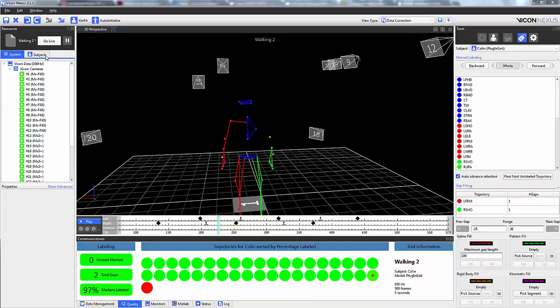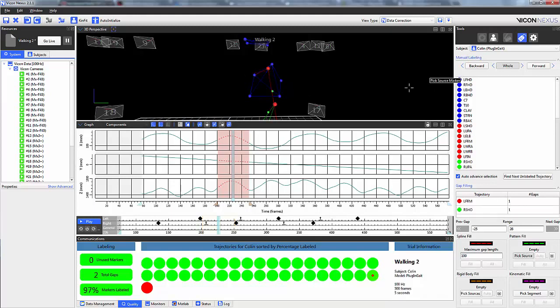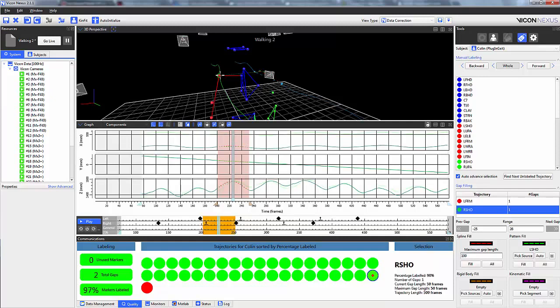In this case, I'm going to use the left shoulder marker as my source marker to fill the missing gap of my right shoulder marker. As you can see, when I select the right shoulder marker from my label list, the red dotted line representing the spline fill is automatically present. When I select the left shoulder as a source marker, a dotted green line appears in my 3D perspective and a solid and dotted green line appears on my graph. The solid green line represents the trajectory of my source trajectory and the dotted green line represents the predicted trajectory of the missing marker.